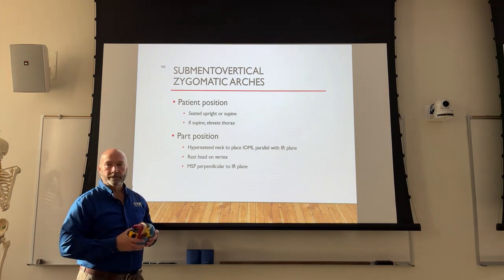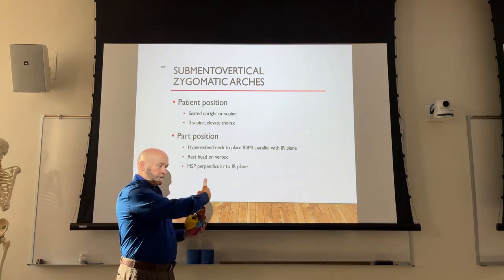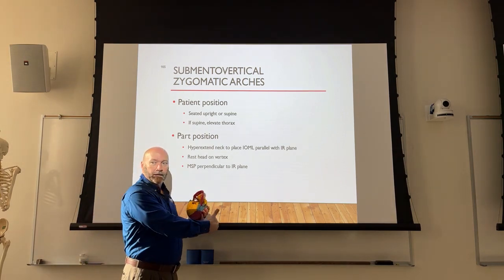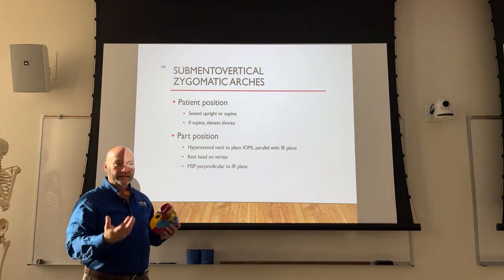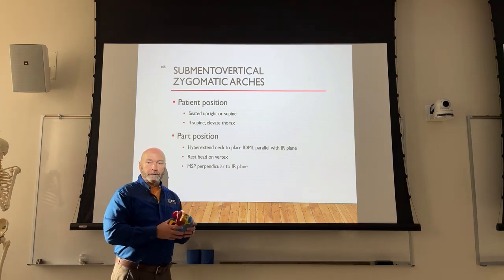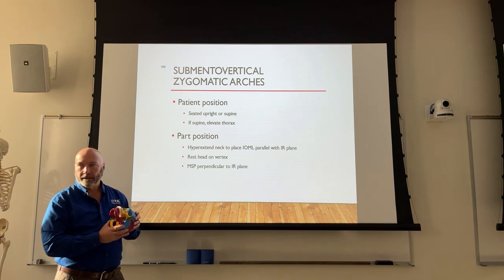Tabletop. Just shoot a tabletop. Well, what if I don't want to put them on the table? Okay, well, just take your image receptor out of the bucky. Be very careful with them because they're expensive. Put it on a table, maybe tape it to the wall bucky, reduce your SID, still shoot a tabletop, right? So instead of 40 inches, maybe 30 inches, maybe even 25 inches, to increase the divergence of the central ray, and you should be able to project them out and away from it.